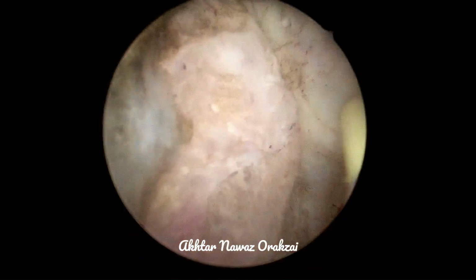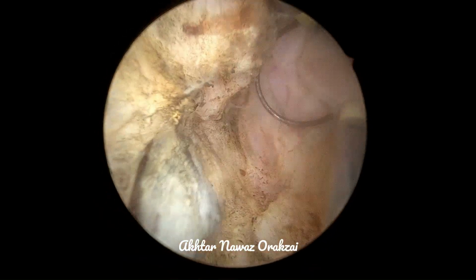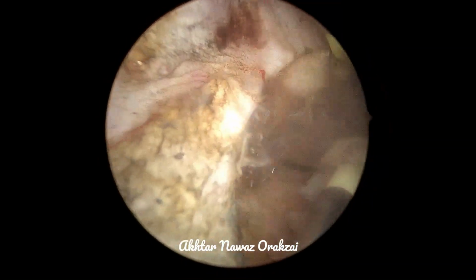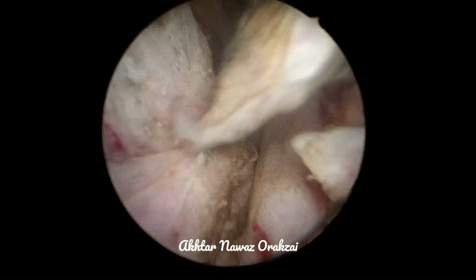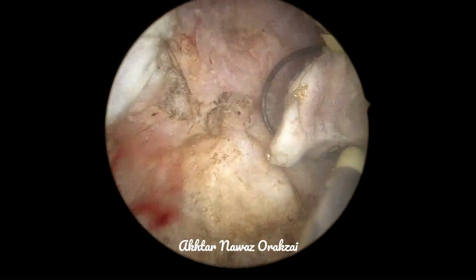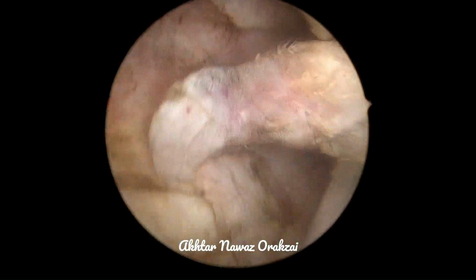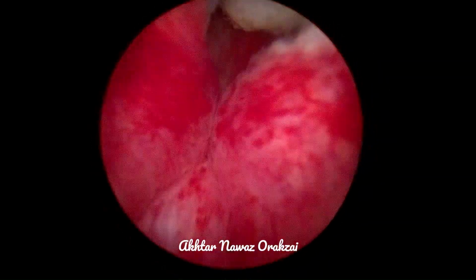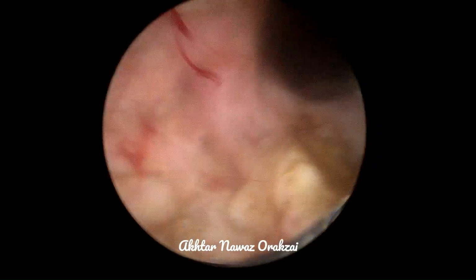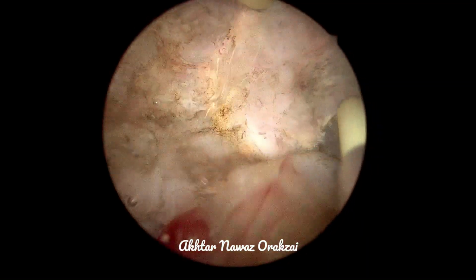However, for the resection to be complete, we need to resect more and more of the parenchyma of the prostate, and in the process on this side as well, we were able to breach the capsule at 1 or 2 locations. However, the breach was not deep enough to produce any significant bleed. We were lucky.